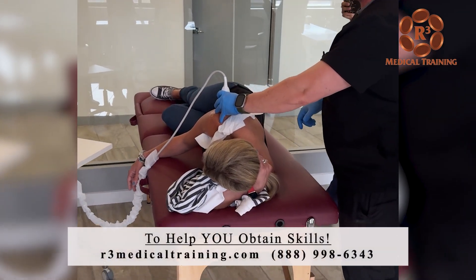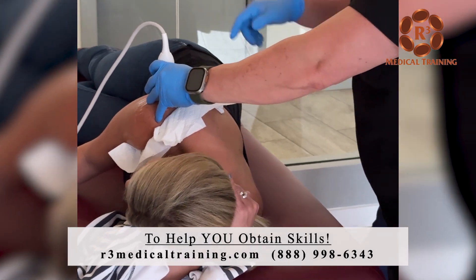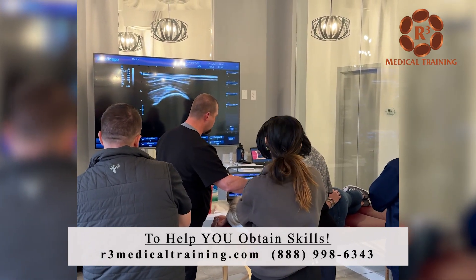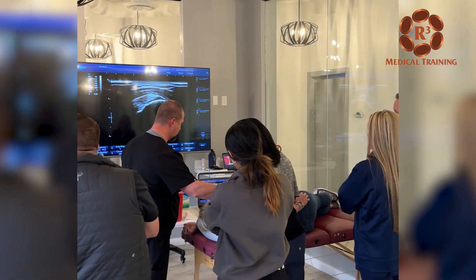So depth-wise, we're at about three and a half, right? So if we're at three and a half, do me a favor — see where those two arrows are? Go ahead and hit freeze. As I worked up towards your head, right, so I went from here. Because almost everybody ends up all the way down here, right there. That's where we're at.